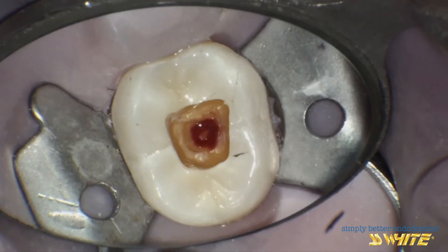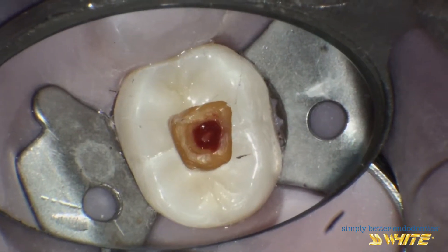This smaller opening conserves as much paracervical dentin as possible for strength.